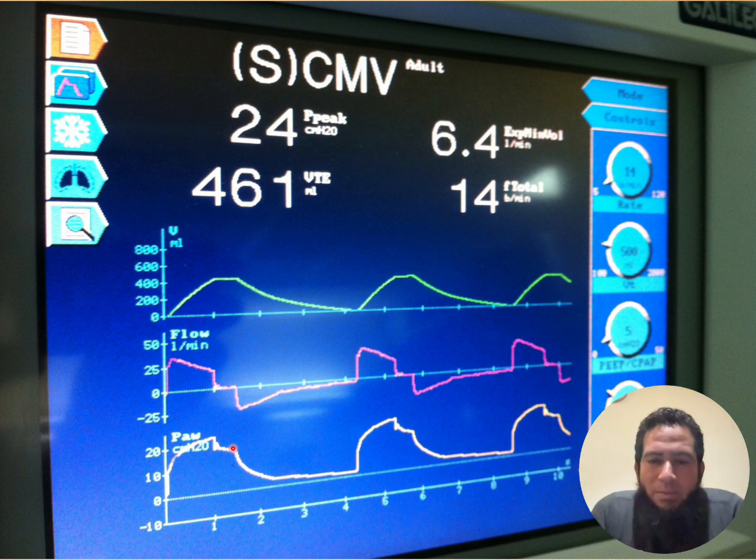So that's it. This is the part of mechanical ventilation that is sometimes a bit difficult to understand when you read from the books. I am not going to talk about the initial settings of mechanical ventilation, how much the tidal volume per kg should be, 6 mL per kg for example, and if you are in a protective lung strategy, and in COPD exacerbation it can be 7 or even more.